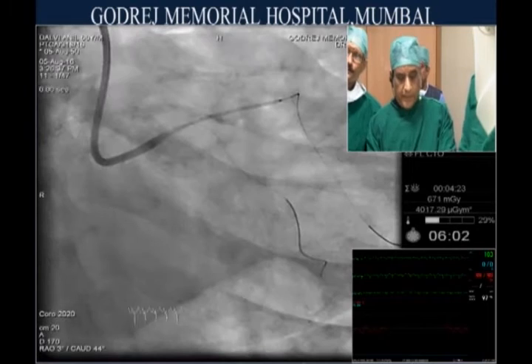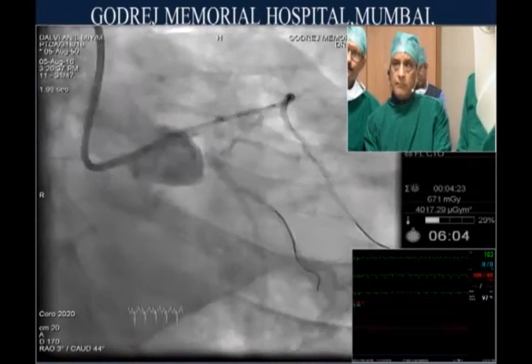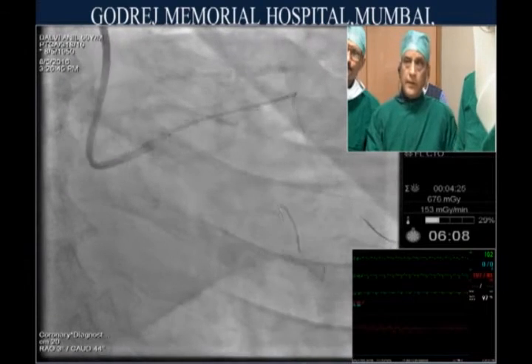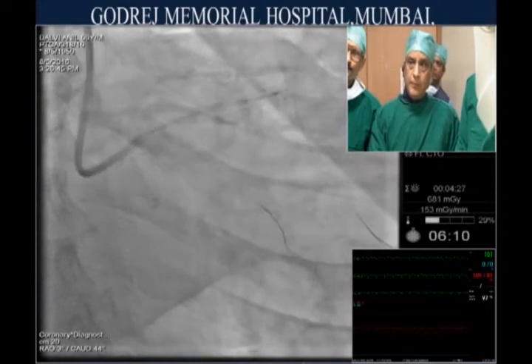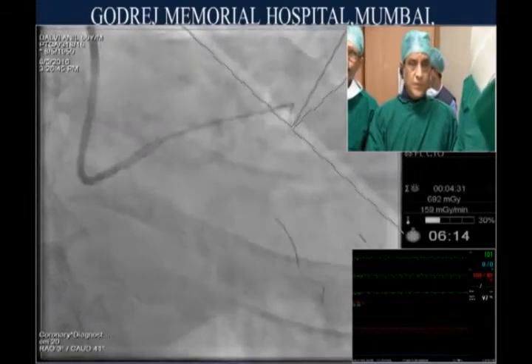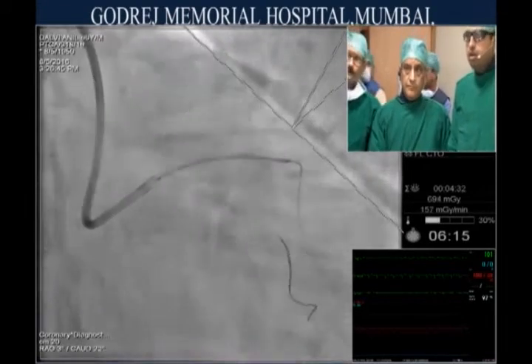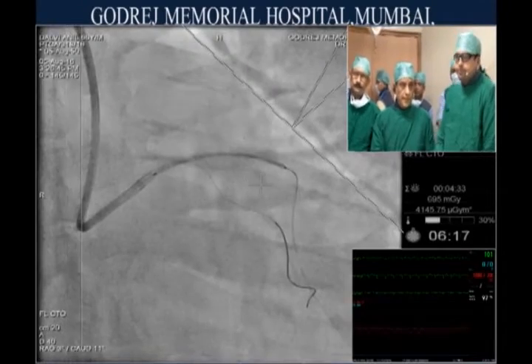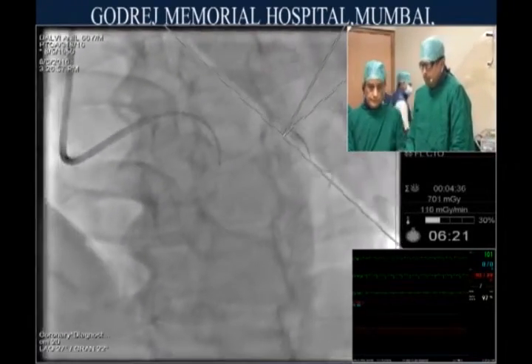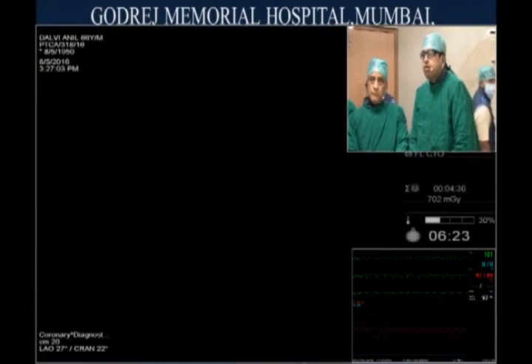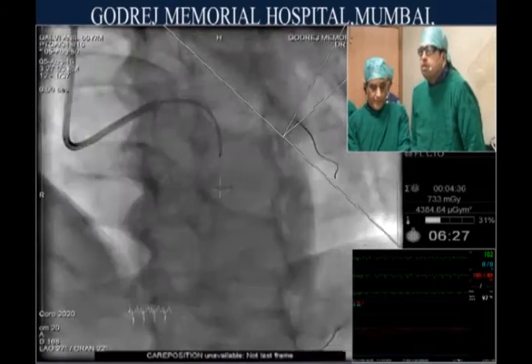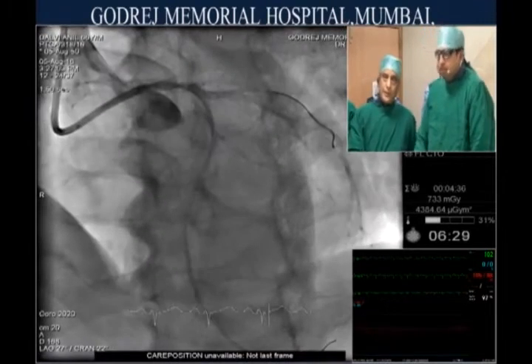We need to go inside a little. An LAO cranial view might be more helpful here. Pull back for coverage of that ostium. This actually provides better coverage — pull back two millimeters.